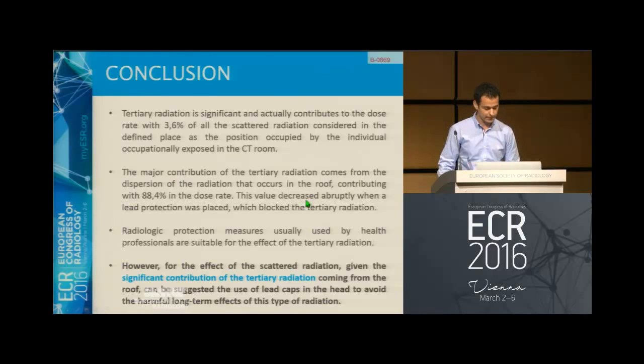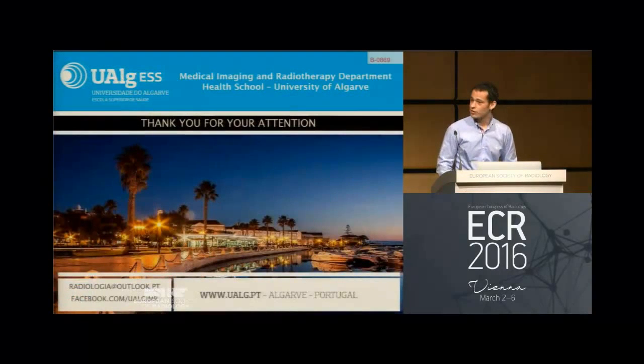which is very important. Usually the radiological protection measures taken by radiographers are efficient, and usually they are enough. However, given the effect of the scatter radiation, especially on the roof, we have to take into account maybe some additional measures of radiation protection, maybe some lead caps for the head or a similar instrument, to avoid the harmful long-term effects of this type of radiation. So thank you very much for your attention.